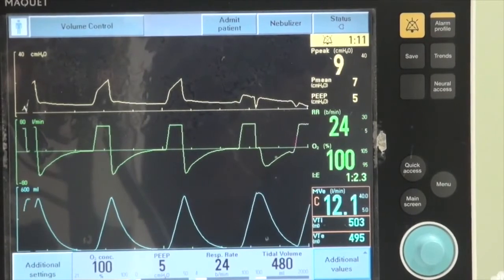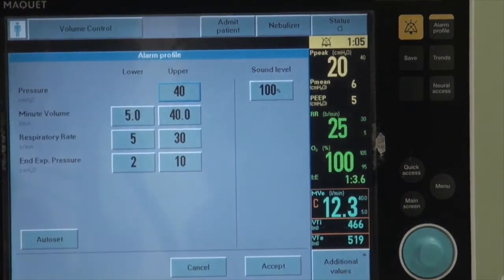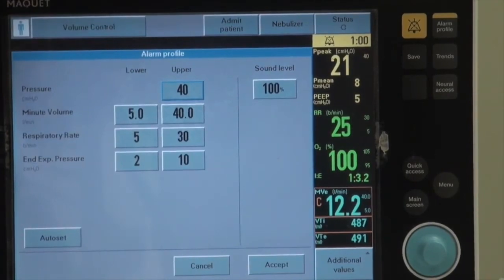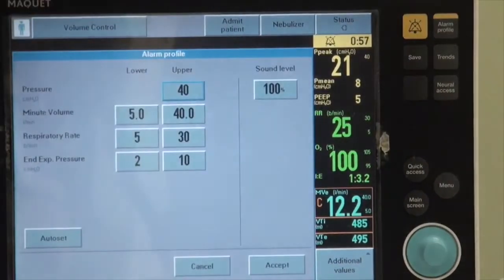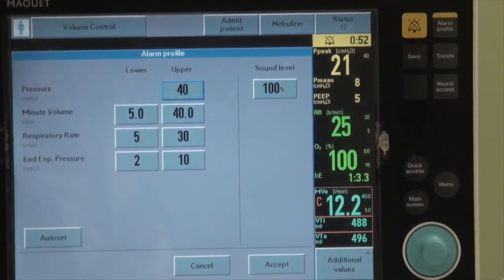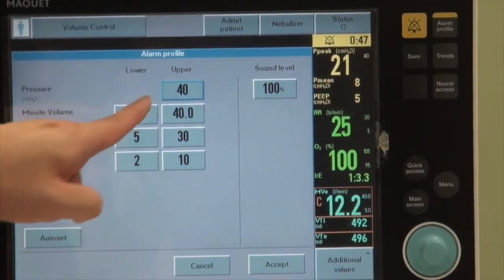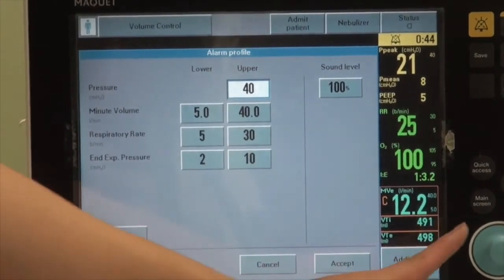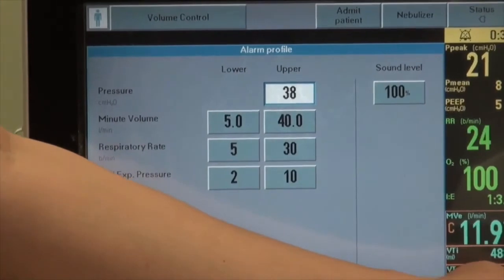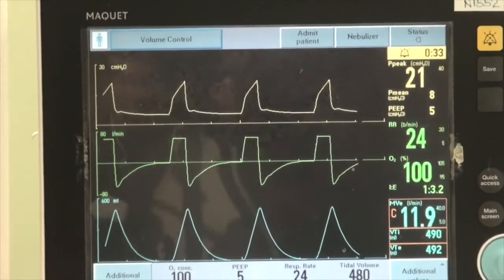After setting up the patient, we also need to adjust the alarm profile, which gives the ventilator its upper and lower limits for alerting the care provider. When you press the alarm profile, you go into a screen where you can make adjustments for parameters like pressure, minute volume, respiratory rate, and expiratory pressure. Make adjustments by pressing the button, turning the dial, and pressing down to select. Press the alarm profile again to return to the main screen.